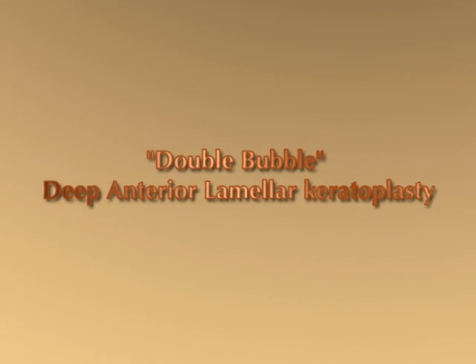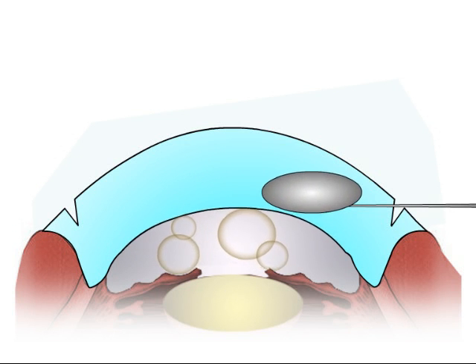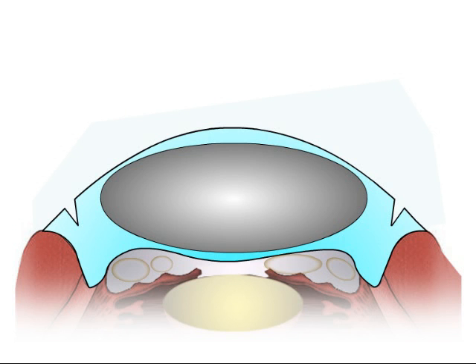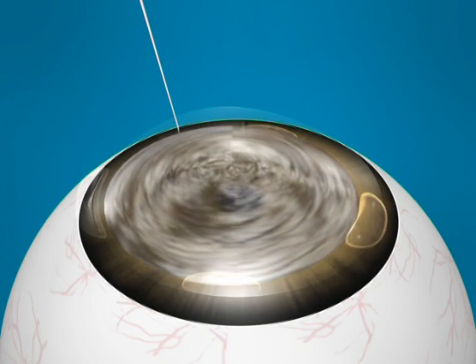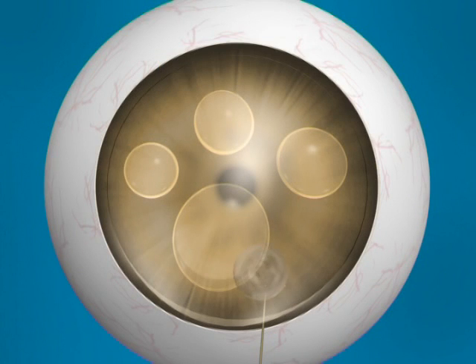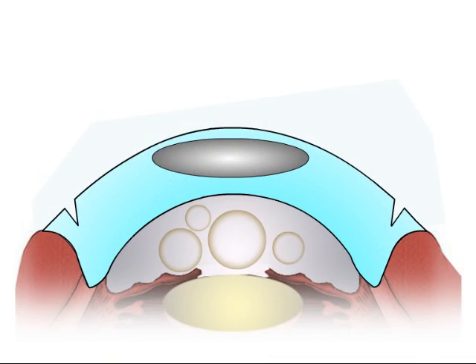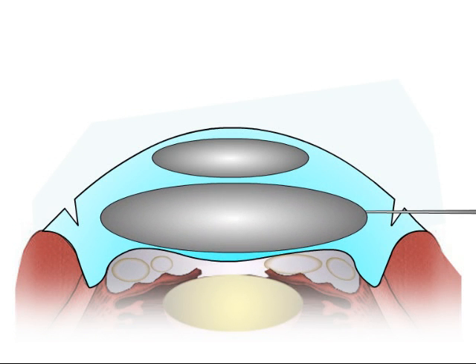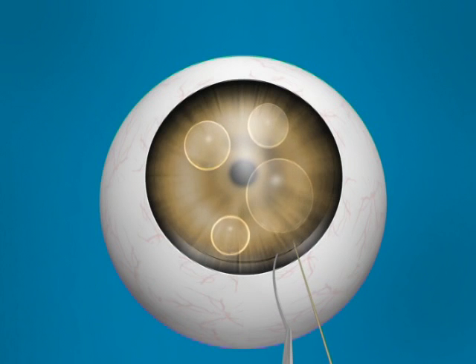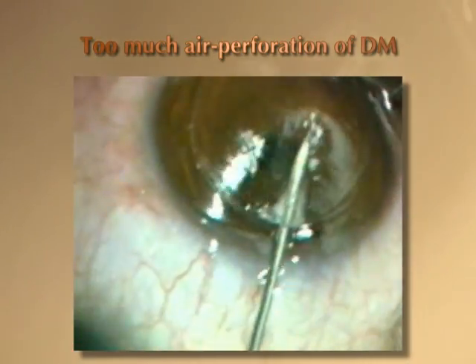The advantages of our technique include the following. First, a real-time evaluation of the recognition of the big bubble: as soon as a big bubble is formed, there is a sudden peripheral movement of the air from the center of the AC due to the inward bulging of the Descemet's membrane. Being a dynamic sign, this sudden movement of the small bubble is easily appreciated by the surgeon. If the small bubbles do not move towards the periphery of the AC after the injection of air into the cornea, this indicates that the Descemet's membrane is not bulging into the AC and that the big bubble has not formed. In such situations, a re-injection of air may be performed from a clear part of the cornea with or without first debulking the anterior corneal stroma. Moreover, the immediate recognition of the formation of the big bubble is advantageous, as it prevents injection of too much air into the cornea, which may cause perforation of the Descemet's membrane.